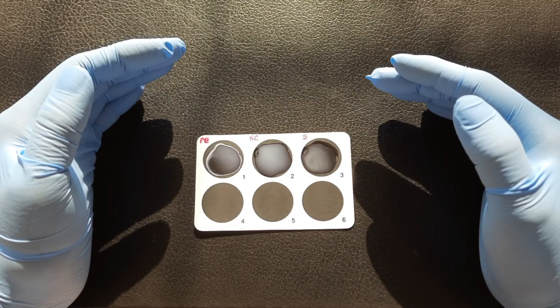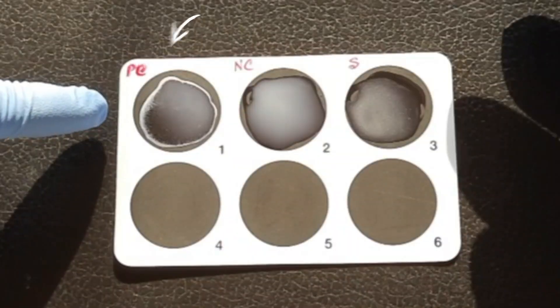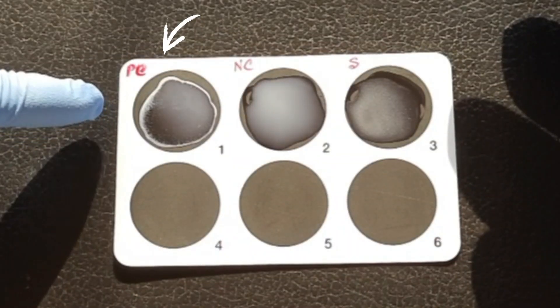You are seeing here the positive control circle shows agglutination. That proves the validity of the test reagent.